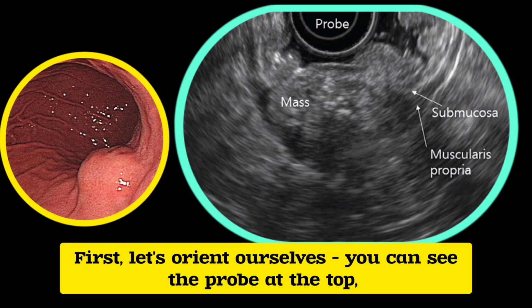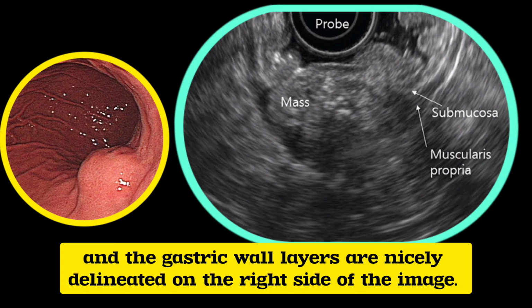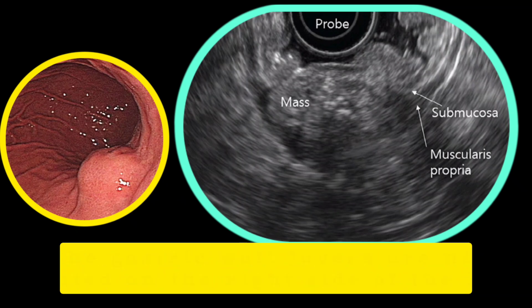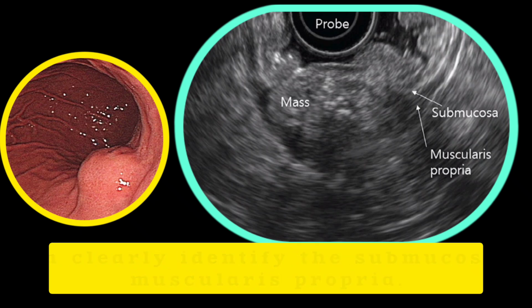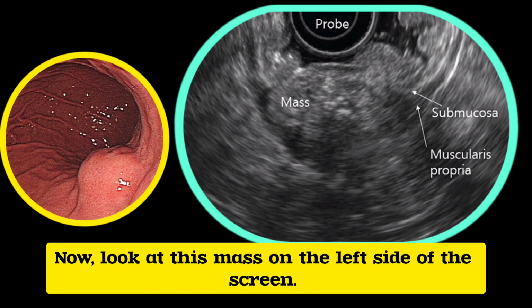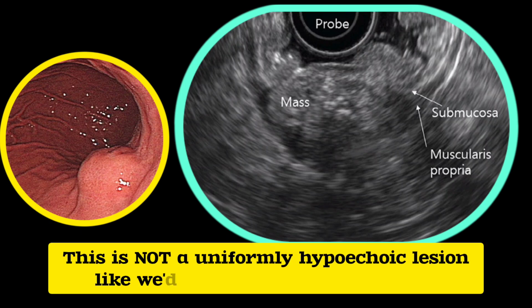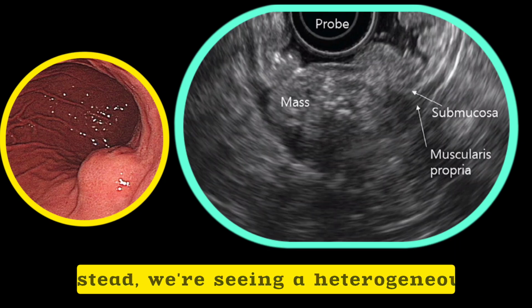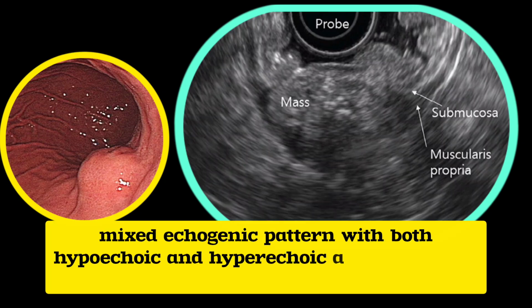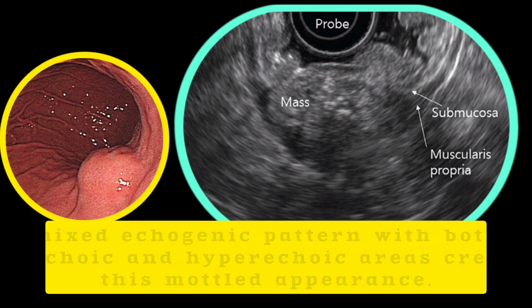First, let's orient ourselves. You can see the probe at the top, and the gastric wall layers are nicely delineated on the right side of the image. We can clearly identify the submucosa and muscularis propria. Now, look at this mass on the left side of the screen. Notice several key features. This is not a uniformly hypoechoic lesion like we'd expect with a typical GIST. Instead, we're seeing a heterogeneous, mixed echogenic pattern with both hypoechoic and hyperechoic areas, creating this mottled appearance.